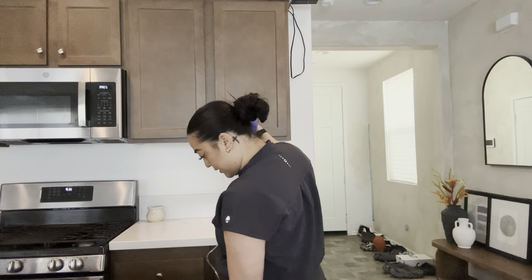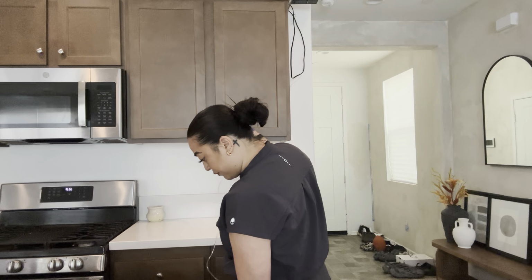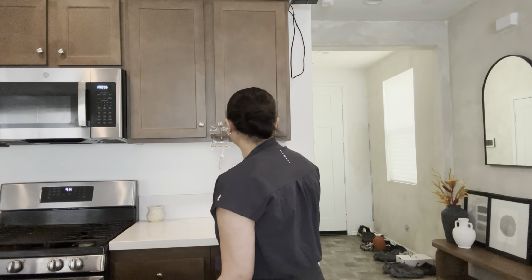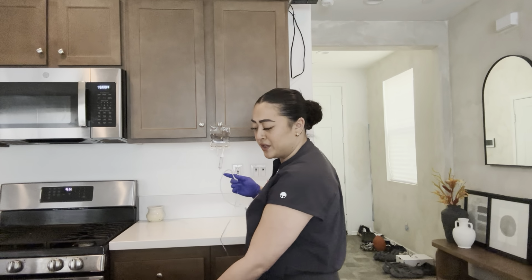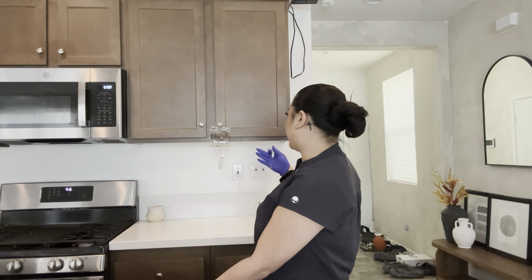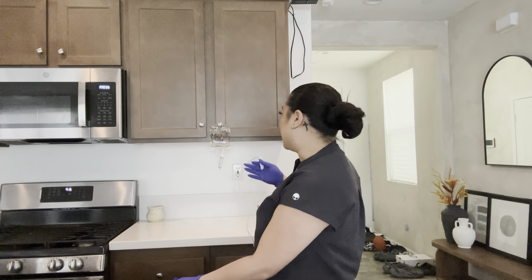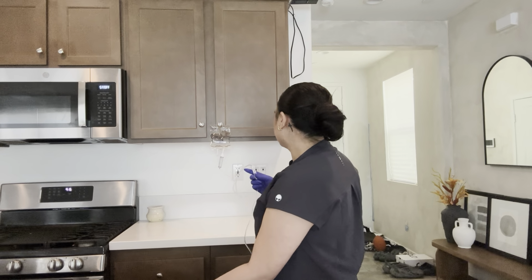Make sure that it's coming out. There we go, perfect. So I'm checking the integrity of everything too. I don't believe I mentioned that, but just to ensure that it's the right expiration date and everything, make sure that it doesn't look cloudy and the integrity is good there.